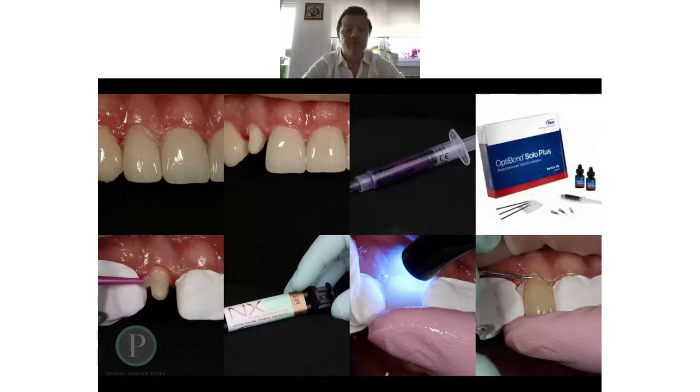And I want to mention the rubber dam. I don't have the skills to put a rubber dam on 28 units. So when I have a smaller number of units, of course, especially in the lower jaw, we try to use it. But can you imagine this case? You put the clamps and you need to cement 28 units, and because of the clamp, one or 2 teeth start bleeding. It's very hard to stop the bleeding when you have 28 units instead of 3 or 4.